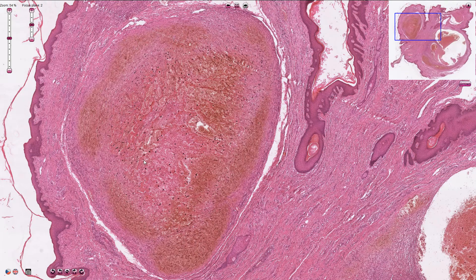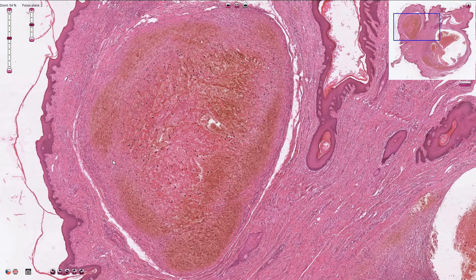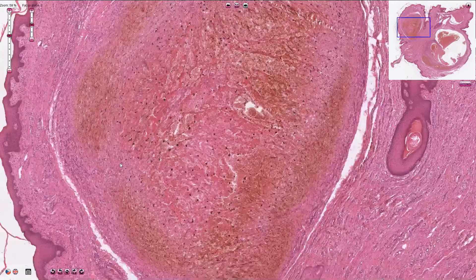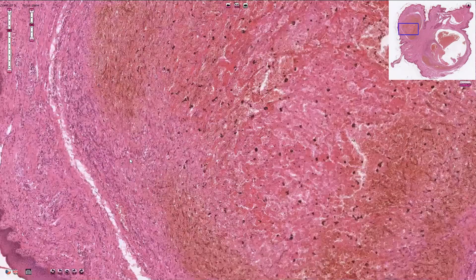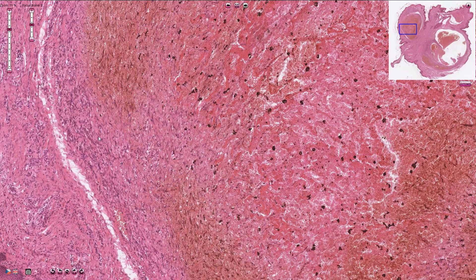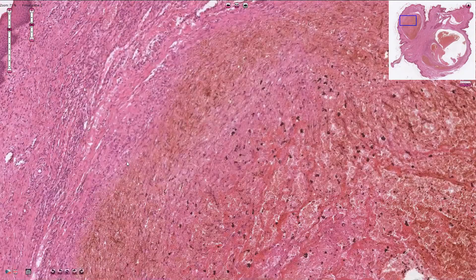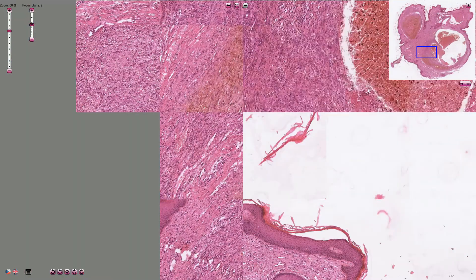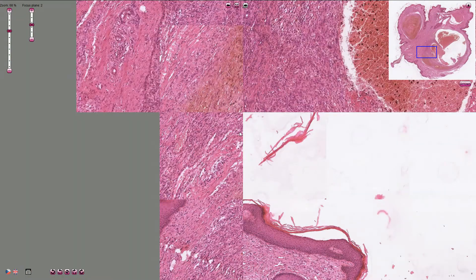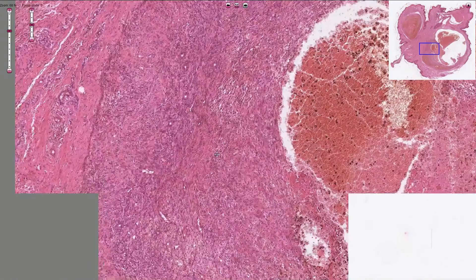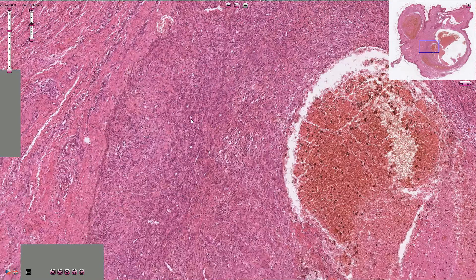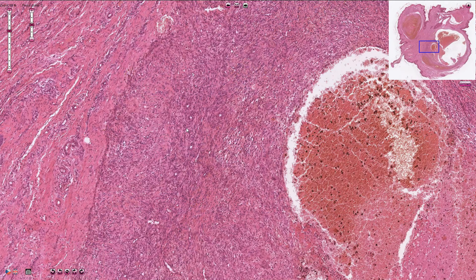Lines of Zahn are usually less prominent in venous thrombosis — they are very clear in arterial thrombi where the blood flows faster. We will cover the lines of Zahn in a different slide. Organization of the thrombus means ingrowth of smooth muscle cells and fibroblasts into the thrombus, and we can also see neovascularization. All of these cells are fibroblasts and some are smooth muscle cells. Let's have a look here — we can find some small capillaries, and here we have some capillaries. This is basically granulation tissue.